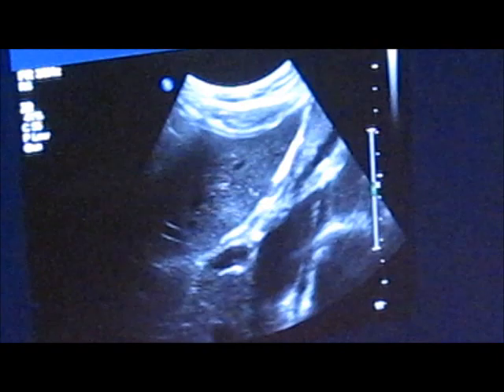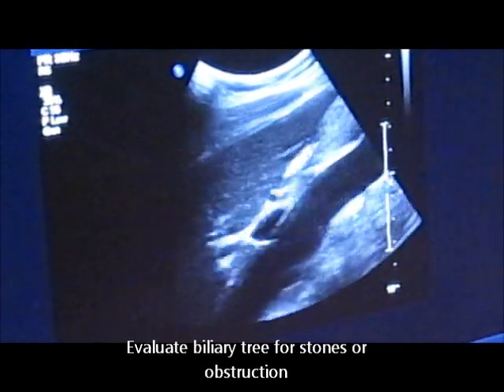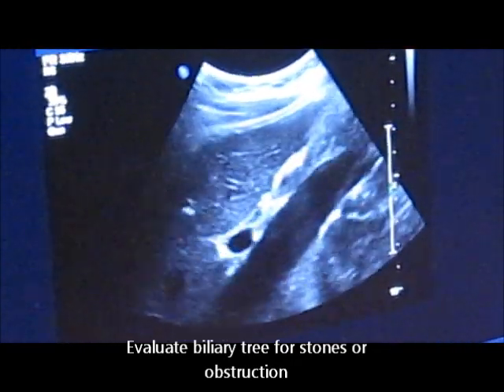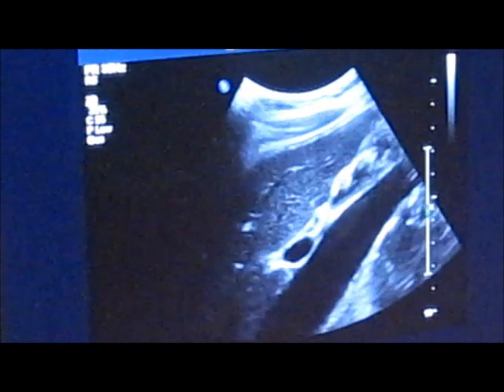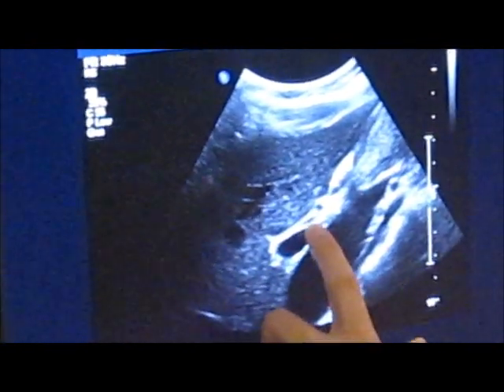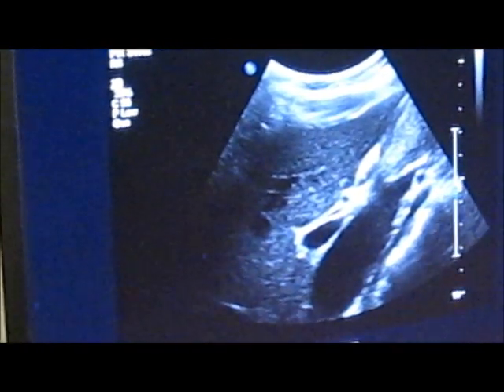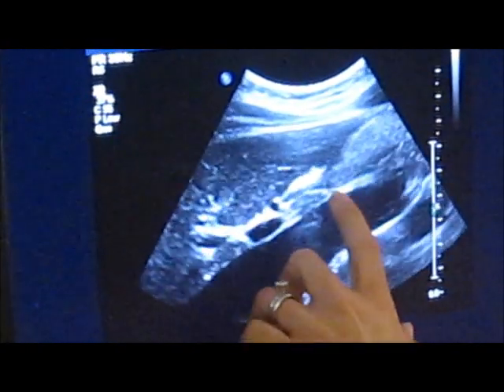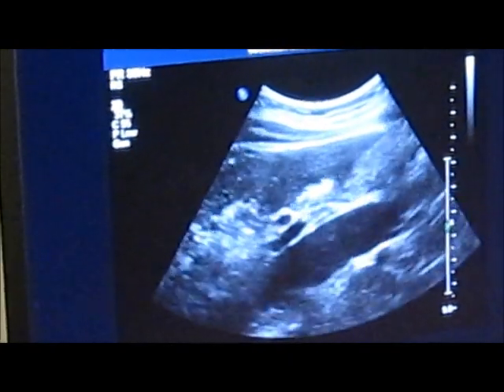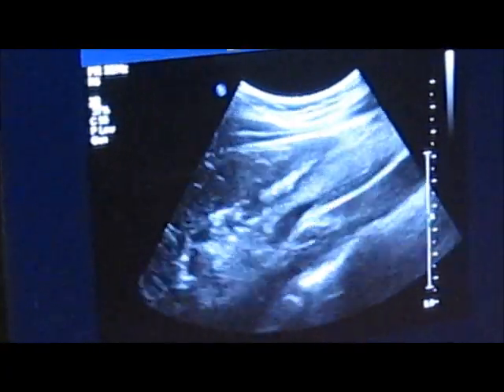And then the other part of the biliary tree is your common bile duct and common hepatic ducts. When they're normal, they're rather small. It's a little harder to find. So this is going to be part of the end of the common bile duct and the start of the common hepatic duct because it's going into the liver. So it's just this very small black line right here. Can't get it coming out of the middle. And here it is right here, coming off the pancreas, and it's going to go into the liver. You can also get stones within the bile ducts, and then the bile ducts will be looking really big, kind of like the IVC, but you'll see a stone in the middle of it.